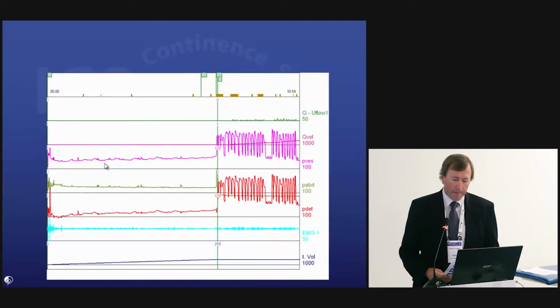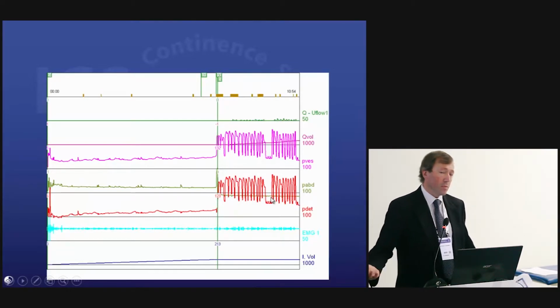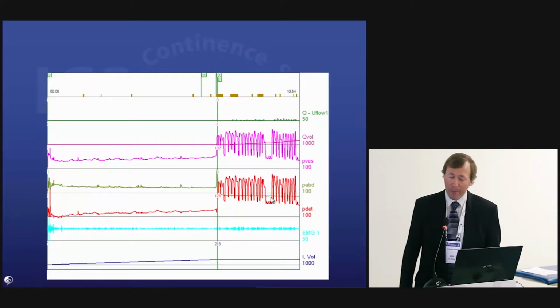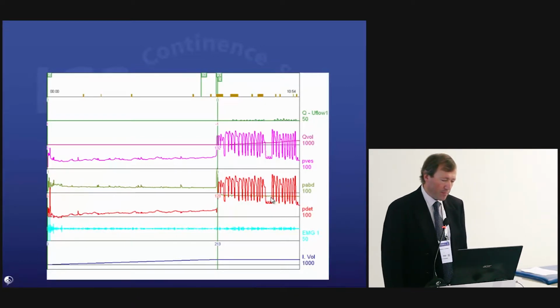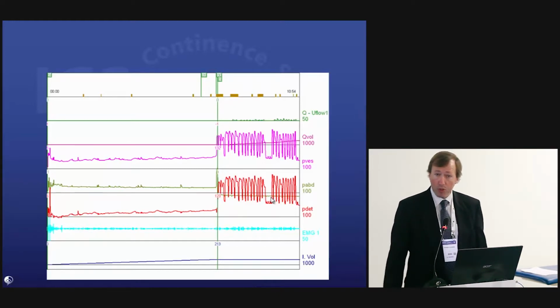Slightly different case here. In this one, it's a little noisy because right underneath all these strains, you can see that the abdominal line, in this case here, has now gone slightly up and then fallen down, gone negative again. So what's happened to that one? Well, it's the abdominal one that's come out this time. And you would normally expect this to happen on a strain if it happens at all.